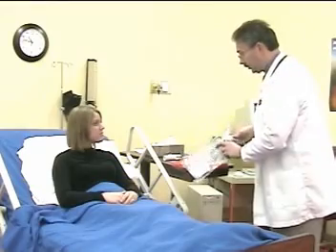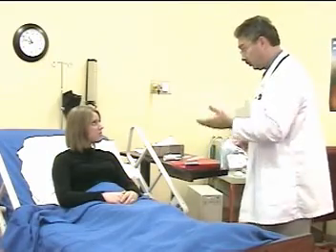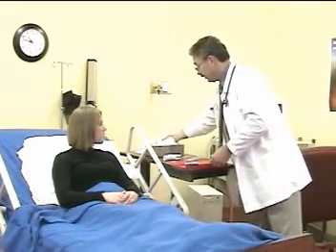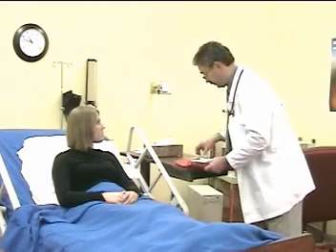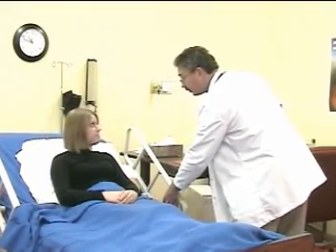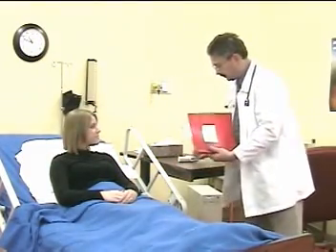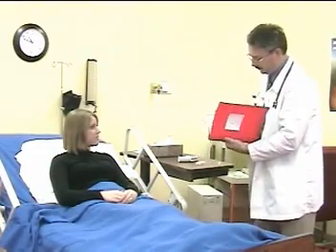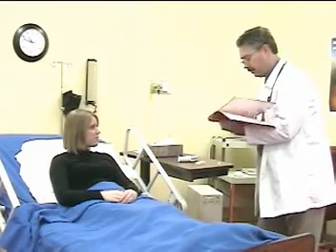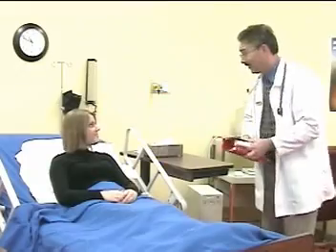You're going to be getting these treatments every four hours. About four hours from now you'll be a little bit short of breath and we'll come around and give you another therapy. You're going to leave the nebulizer here at your bedside. The therapist leaves the patient area safe and clean, lowers the bed, asks if there's anything else needed, and charts the therapy appropriately. Thank you, I'll see you again around three o'clock.